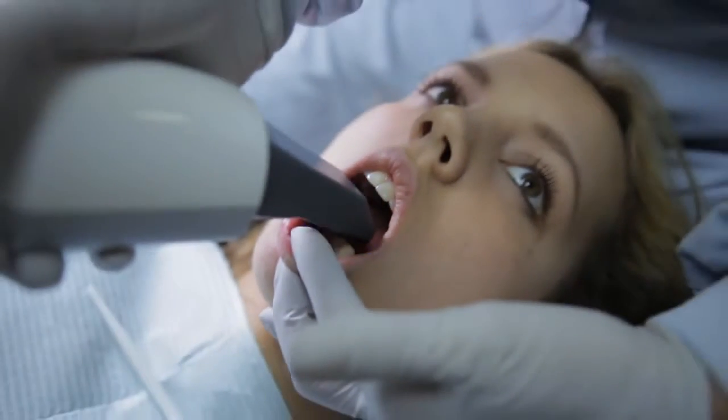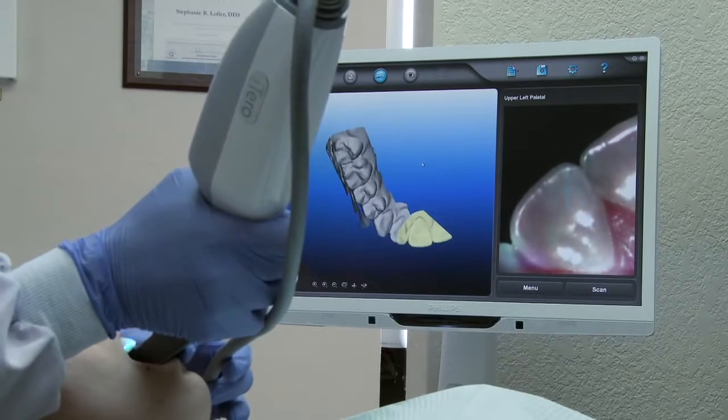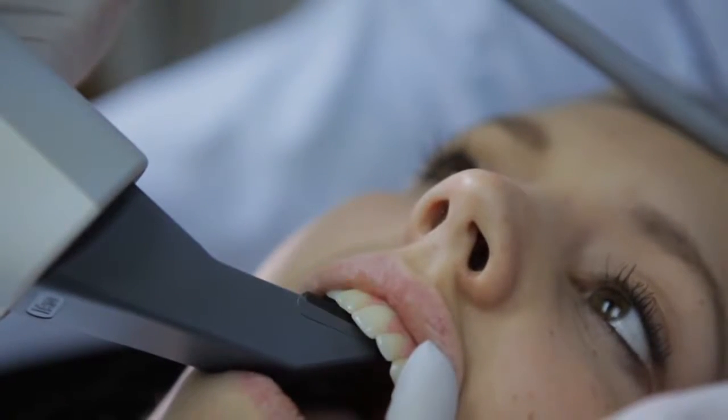Whole tooth images are captured for an extremely accurate scan, which leads to better fitting Invisalign aligners for the patient. And with no messy impression materials to contend with, the patient remains relaxed and comfortable throughout the procedure.